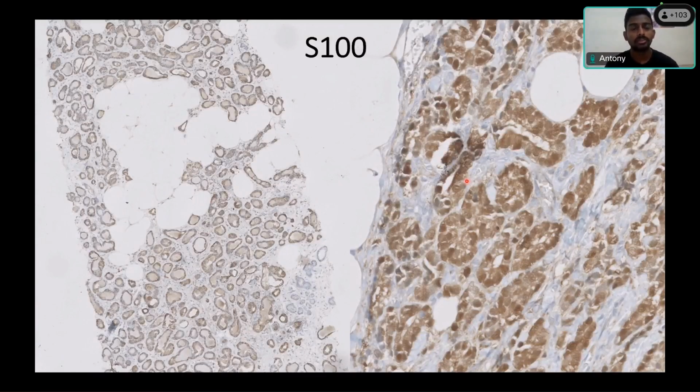So secretory carcinoma architecture is not composed of single tubules haphazardly infiltrating the breast parenchyma. It has multi-layering, and the secretions have larger branching, bigger cystic spaces. It is not composed of individual tubular infiltrates.